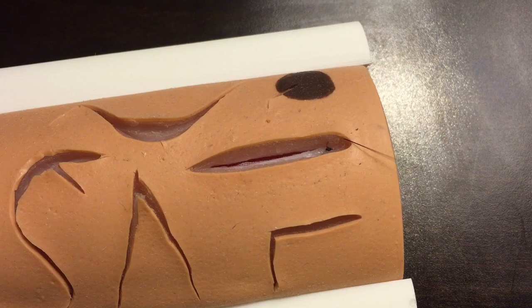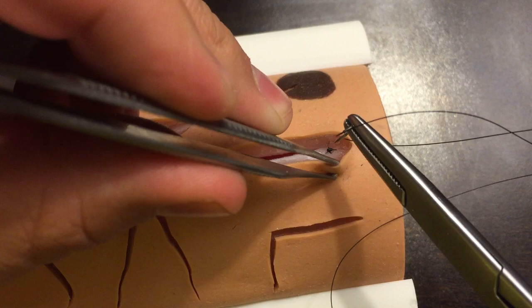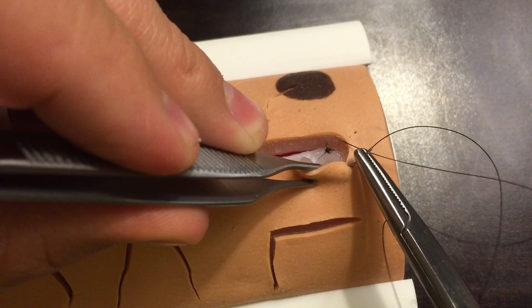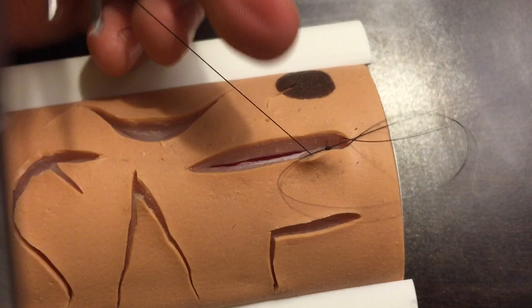As we go, we tighten it up and it will approximate the skin edges. I like to pull the suture across to see exactly where I should be going with my next throw. The positioning is such that you go just underneath the epidermis — just under — and then passing through, just popping out just underneath the epidermis. See how that's done? Pull that through, and it's going to pull that apex close together.